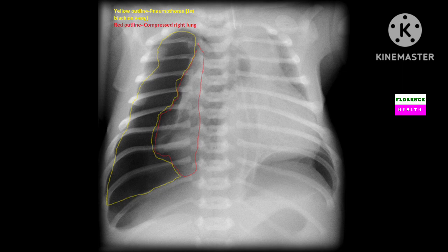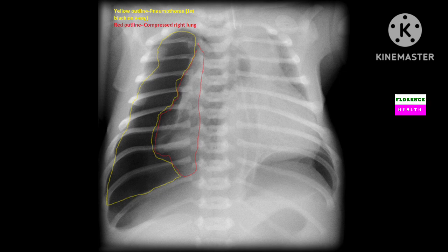One important point to remember: when one lung is black, it is in favor of pneumothorax. When both lungs are black, it is in favor of emphysema. Emphysema is not seen in one lung — emphysema always appears bilaterally.